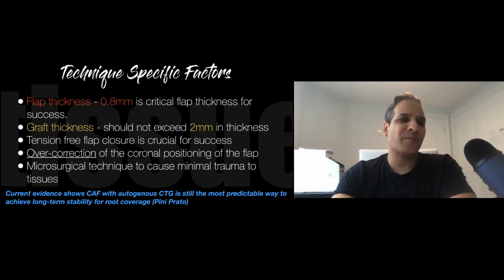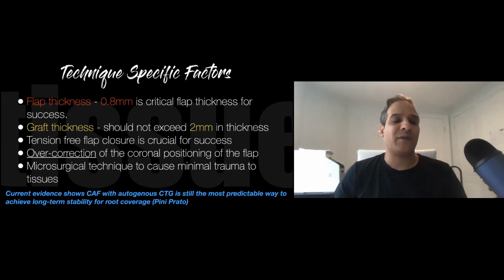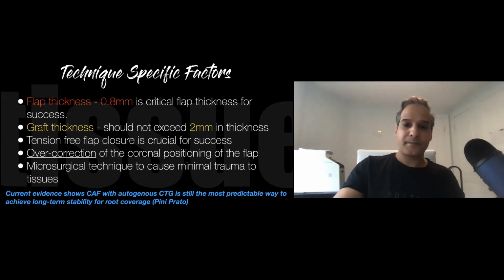And then you want to use microsurgical technique, meaning that you want to use fine incisions. You have to be very gentle with your management. No big flaps where there's tearing and things like that. So you want to cause minimal trauma to the tissue, because it'll heal much faster and you have less disruption of blood supply to the area.